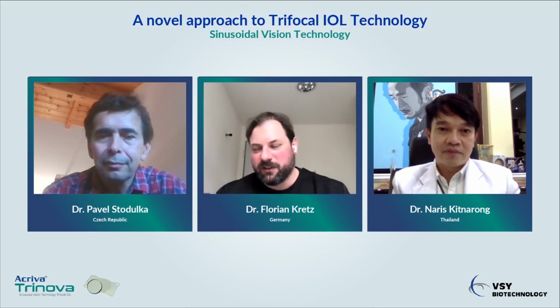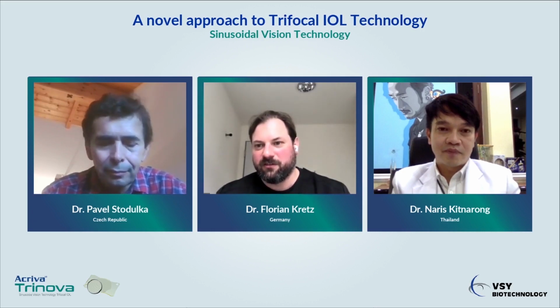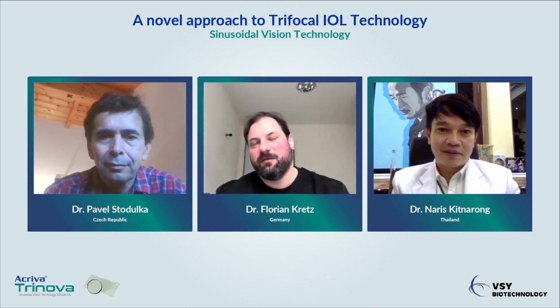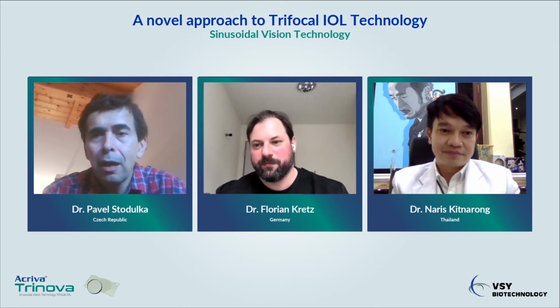But there is a simple trick. You just turn on the backlight of the navigation and your pupil constricts a little bit more. So if you measure it, yes. For daily routine, I would rather say only sometimes there are other effects that have a greater impact for the Acriva Trinova technology. Oh, thank you.